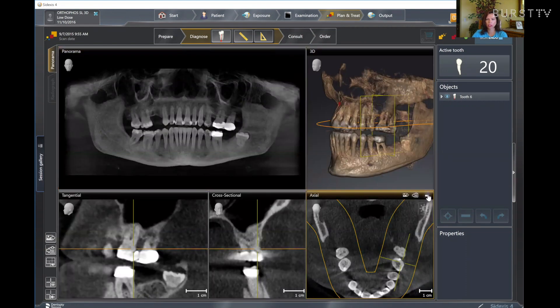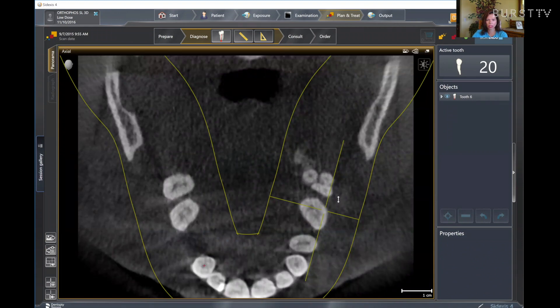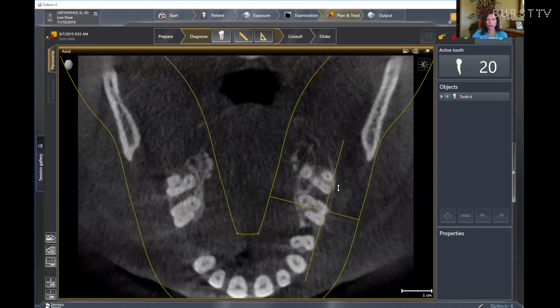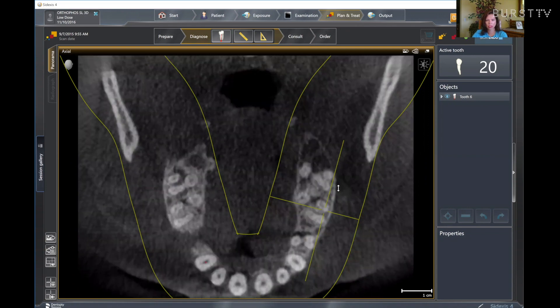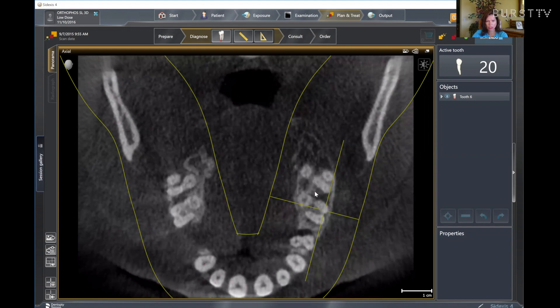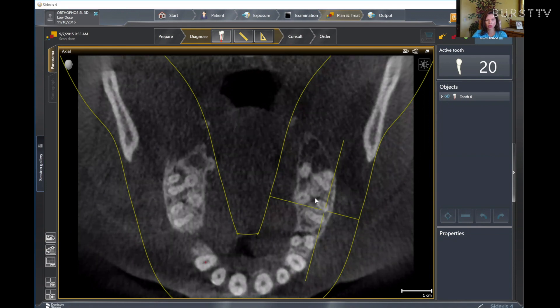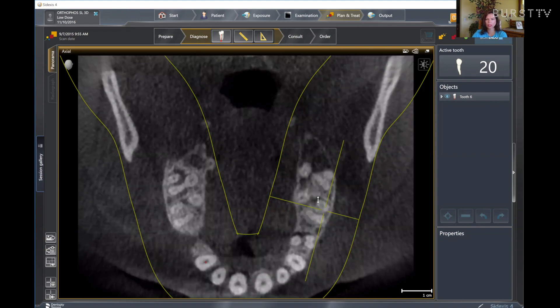Going into our axial view and enlarging the screen, scrolling up to the maxillary area, we can now see the amount of bone loss. Do you see this radiolucent area right here? That is the amount of bone loss in that area. These are the separated roots. We can see into the furcation area how far down the bone has deteriorated. This gives us a better idea of what type of instruments to use, what other perio treatments to provide, and a better assessment of root morphology — so if the roots are curved, we know how to navigate into that pocket.